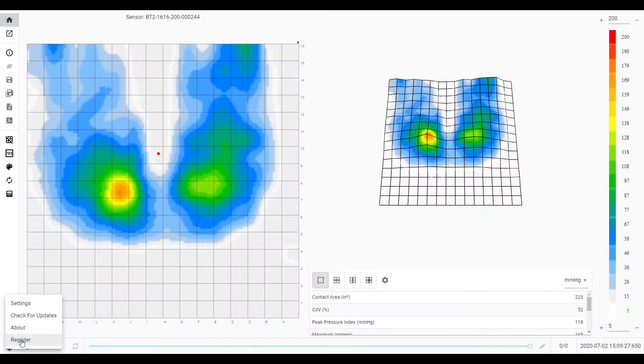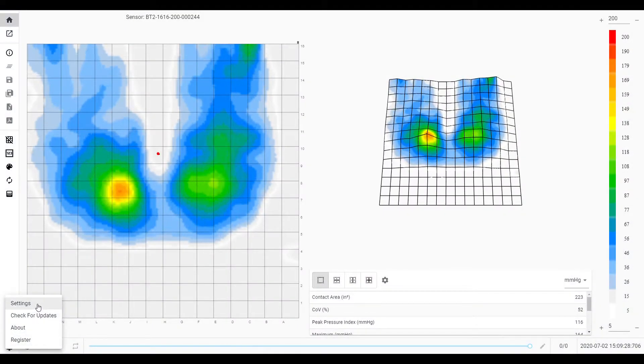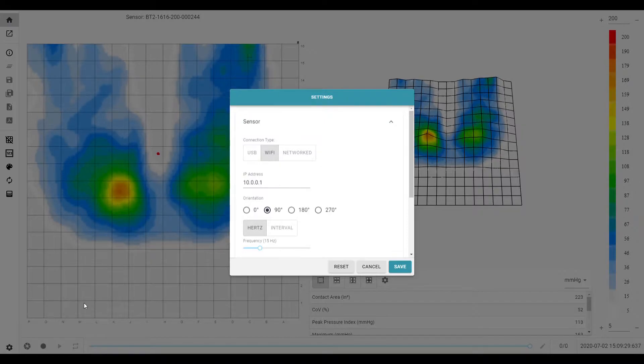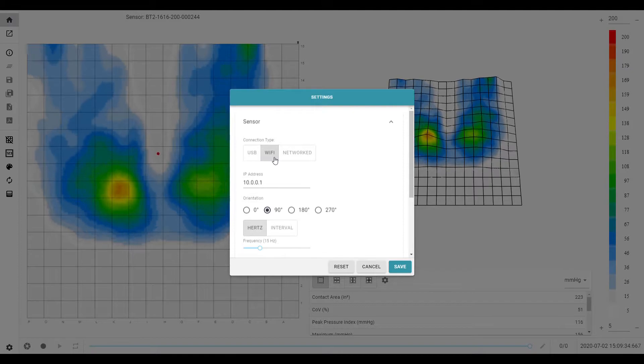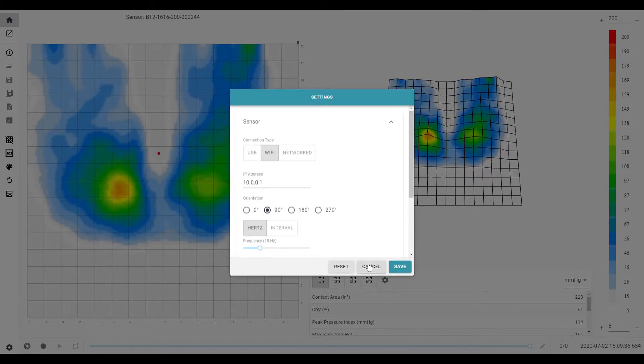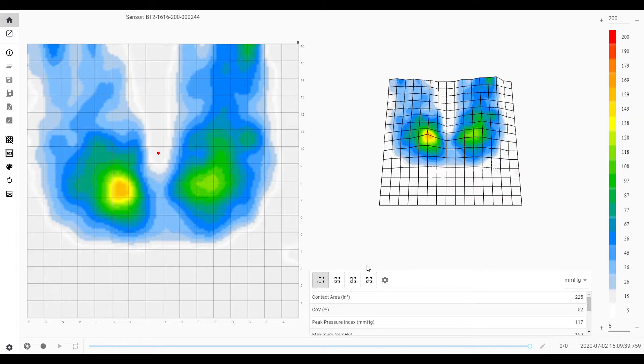No sensor readings. If the software suggests there is no sensor, you will need to connect the mat through the wired USB setting. If you are using the Wi-Fi connection, this must be selected.